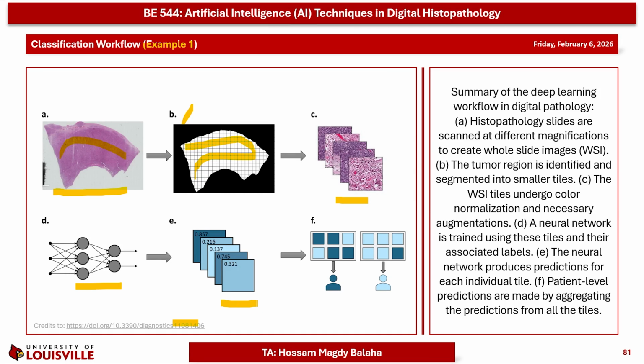Finally, predictions from individual tiles are aggregated using methods like majority voting or attention-weighted averaging to produce a patient-level diagnosis.